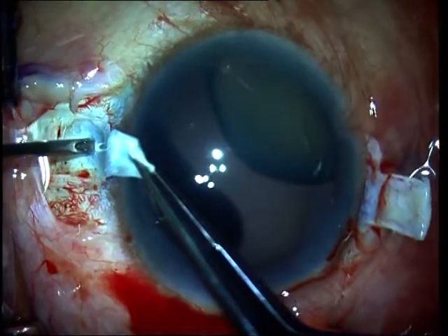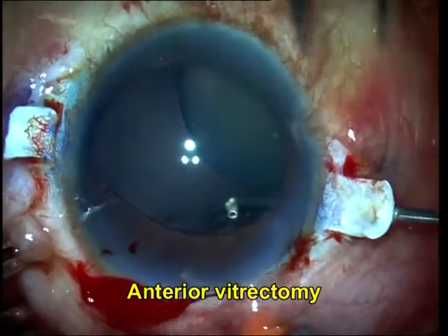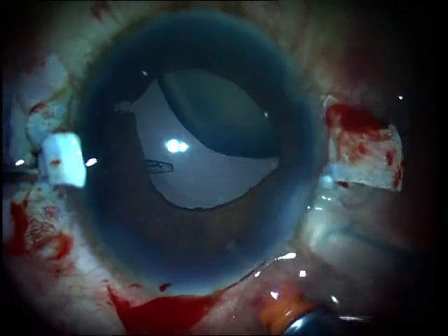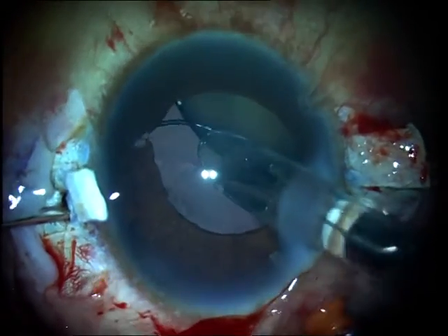Once I have done that, I make 23-gauge sclerotomies under both the scleral flaps and do an anterior vitrectomy through these sclerotomies. Now it would be ideal for me to have a scaffold or a support under the subluxated lens while I am removing it.